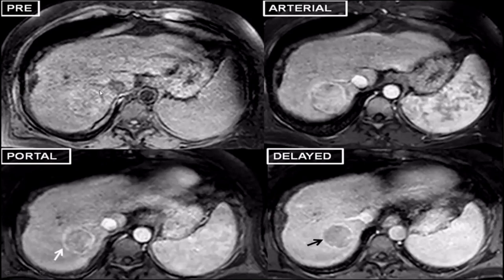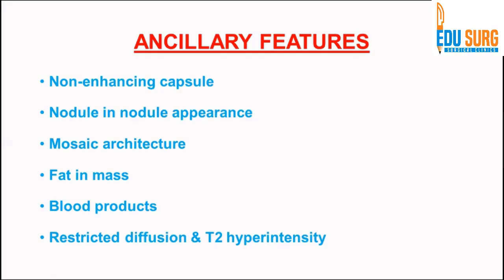This is a classical case of HCC. In the pre-contrast phase the lesion is present, showing non-rim type arterial phase hyperenhancement with the core of the lesion enhancing. In the portal venous and delayed phase, there is non-rim type washout from the lesion. The capsule has enhanced in the delayed phase, fulfilling all criteria. We do not have a previous scan to comment on threshold growth, but this is a classical definite case of HCC.